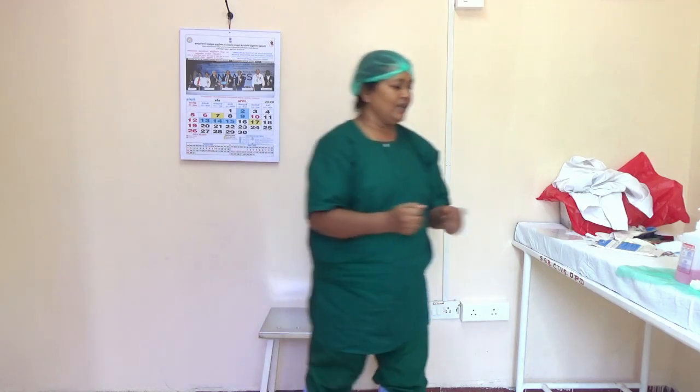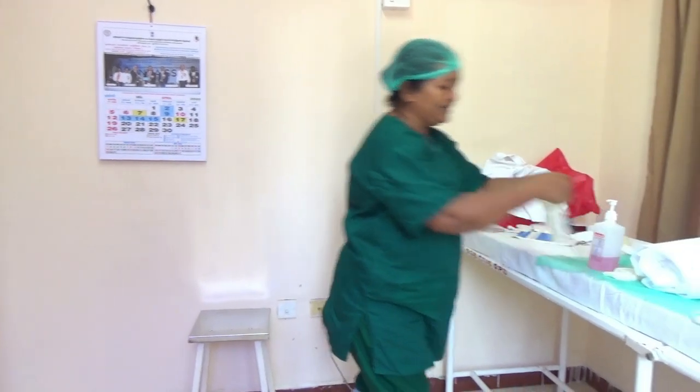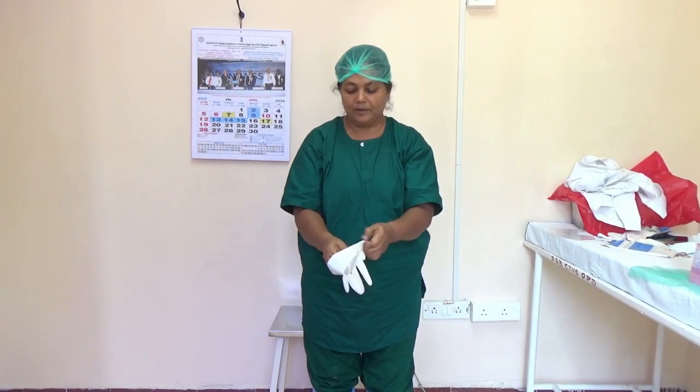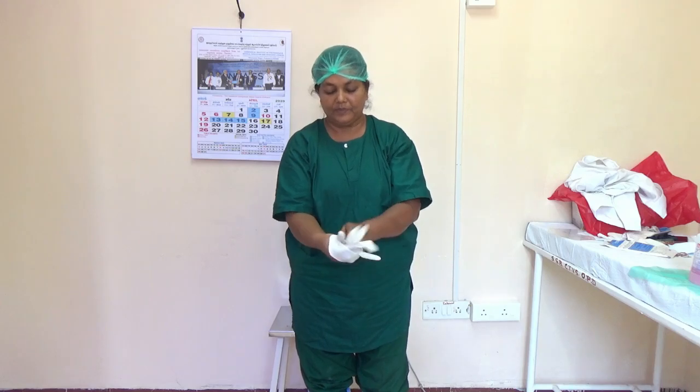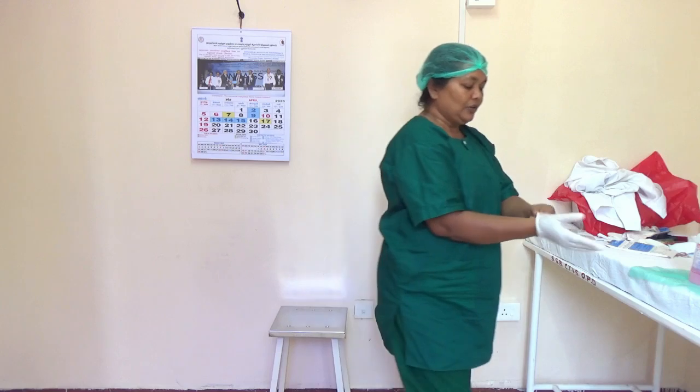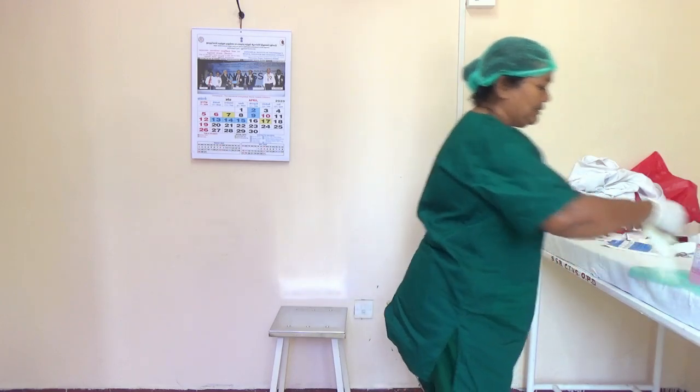After drying the hands, you have to wear the inner glove. Pull it over the hand.